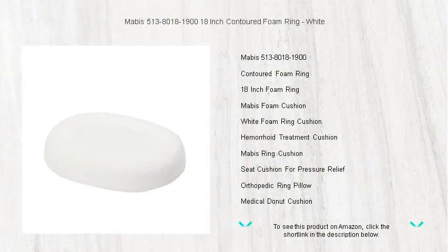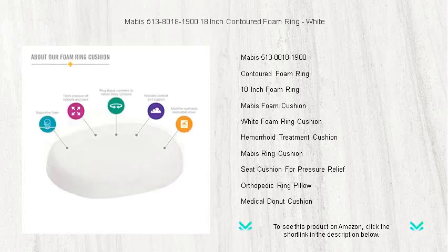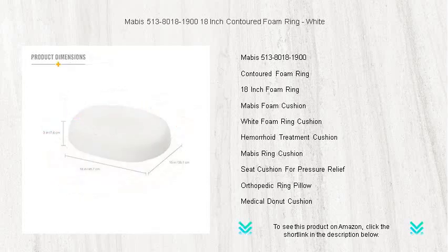Experience comfort and relief with the Mabus 513-8018-1900, 18-inch contoured foam ring. Designed to alleviate pressure on sensitive areas, our foam ring is perfect for individuals recovering from surgery, suffering from hemorrhoids, or dealing with coccyx pain.